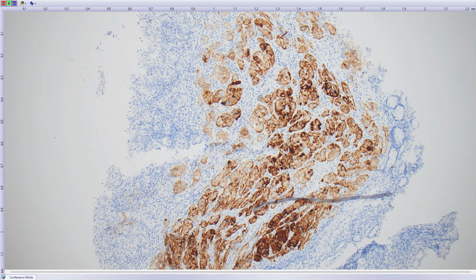The cytomorphology perfectly fits an adrenal cortical tumor, and this oncocytic change is one of the criteria used to predict whether it's adenoma or carcinoma. Okay, the more oncocytic, the more probable it is to be malignant. So not everything positive for synaptophysin is a well differentiated neuroendocrine tumor.